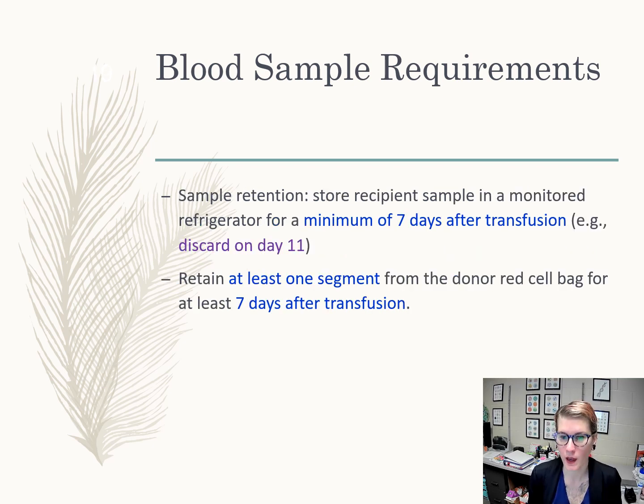So you want to retain that recipient sample for a minimum of 7 days after transfusion. And you want to retain one segment from the donor bag, at least up to 7 days after transfusion. And that's just in case there's a delayed transfusion reaction. You have that sample from the recipient and the sample from the blood so that you can do some tests to see if there was an error performed during the compatibility testing.